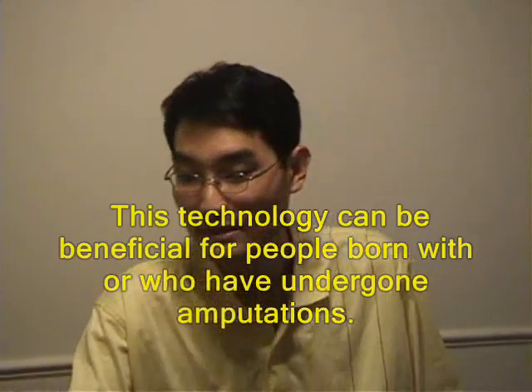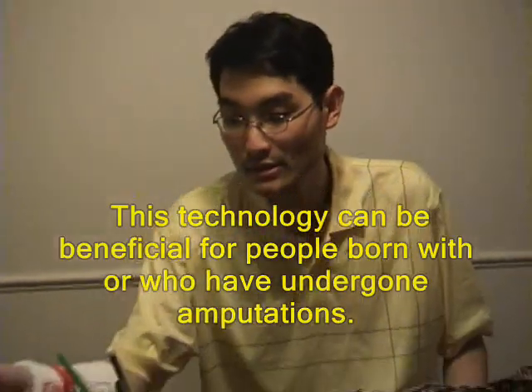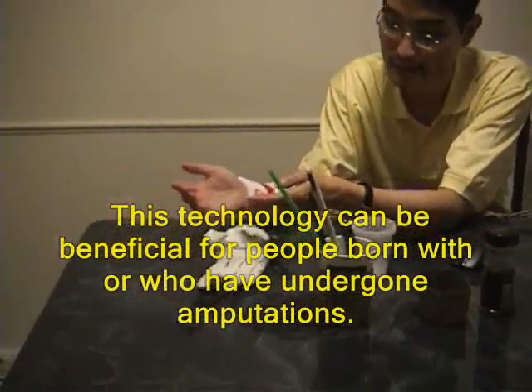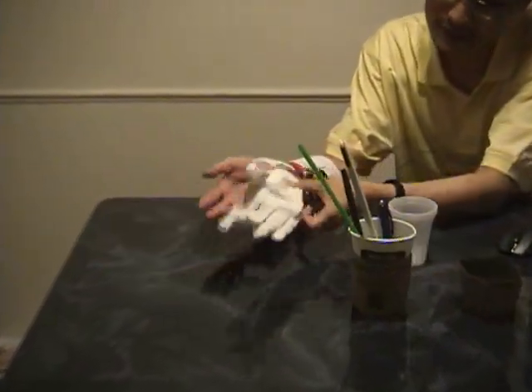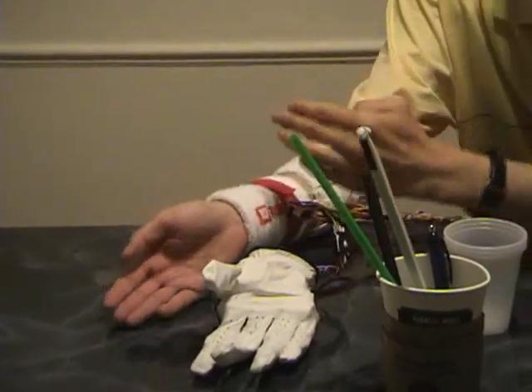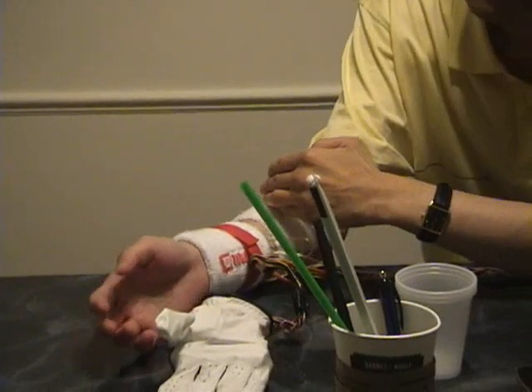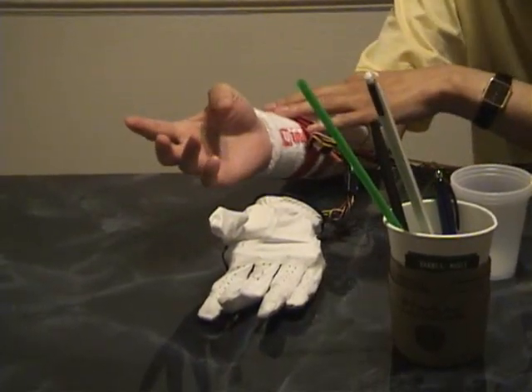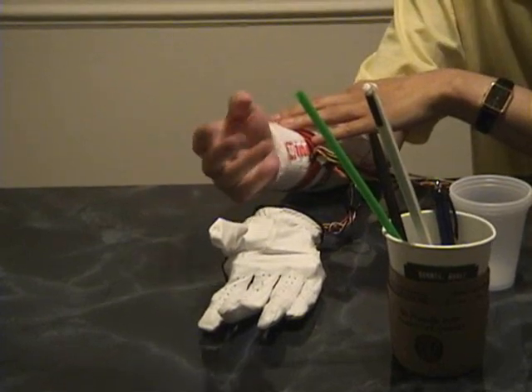Hi, for today's demo, I'm going to demonstrate a mechanical hand here. Basically, if you were to lose your hand during an accident or war, you would attach the hand to your wrist here. It's controlled by your muscle at three points. You control the five fingers through your muscle, so you can pick up daily work.